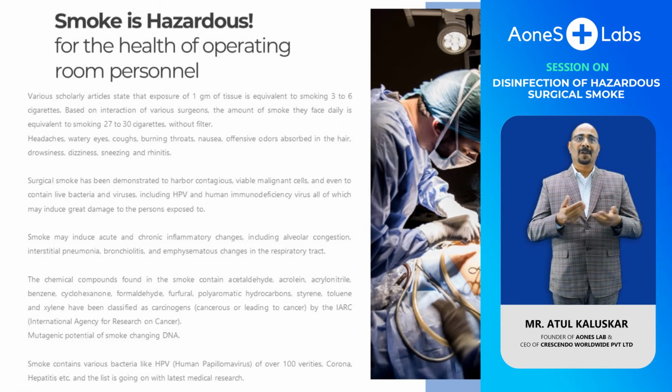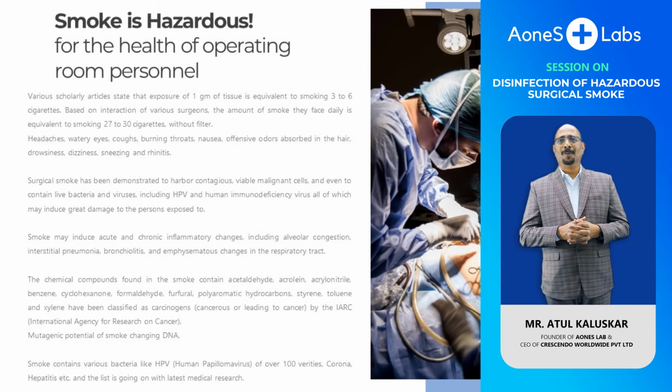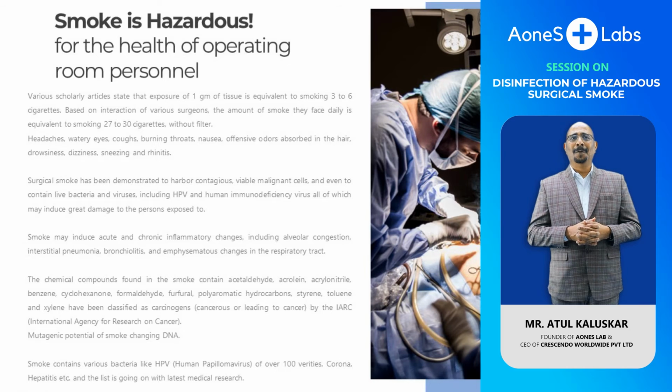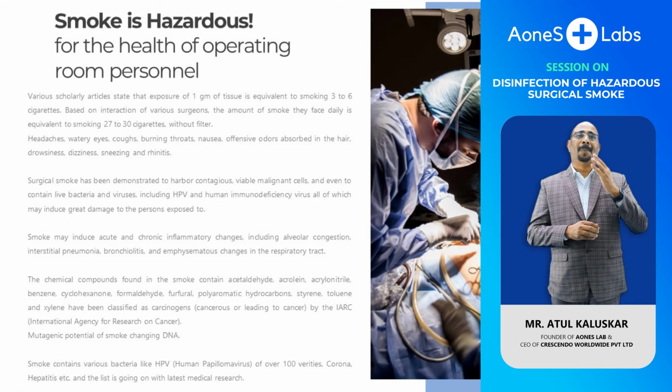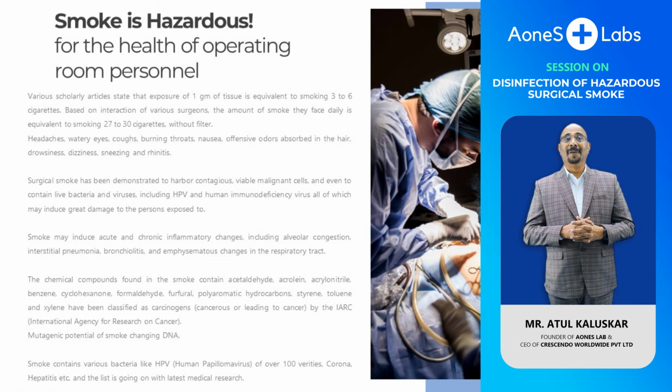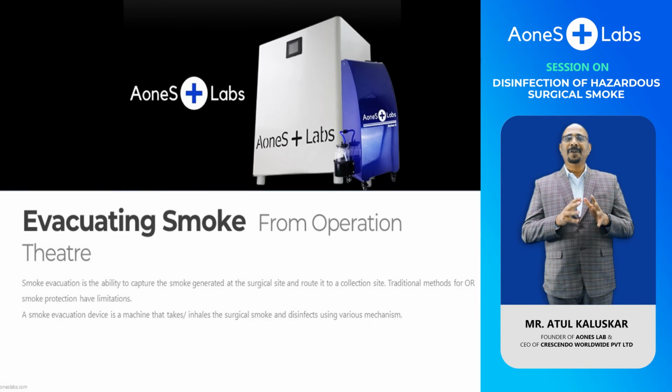While interacting one-on-one with a lot of surgeons, I found hardly a few percent, maybe over 15% of the surgeons, use some rudimentary method, that is passing this surgical smoke through sodium hypochlorite solution or even letting it out directly in the operation theatre. This is very, very unsafe. So we need a smoke evacuation device which will disinfect this surgical smoke.